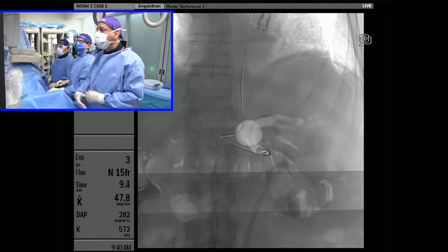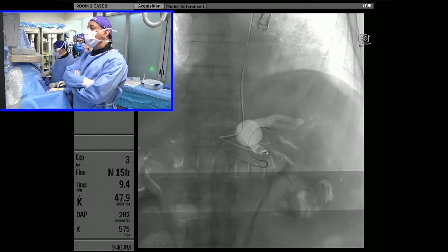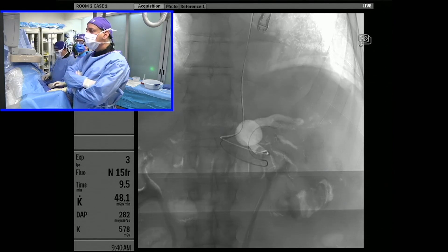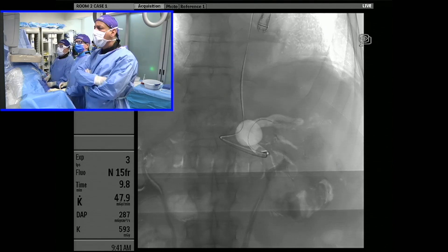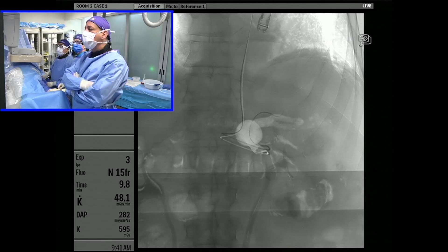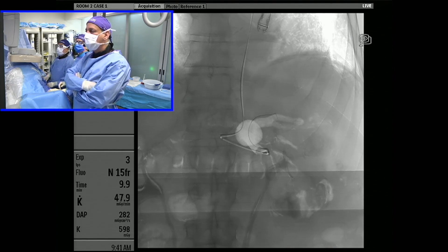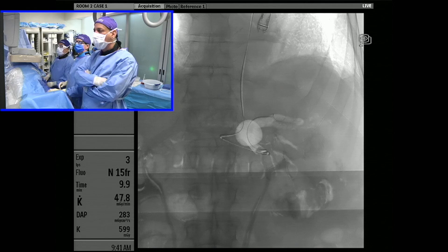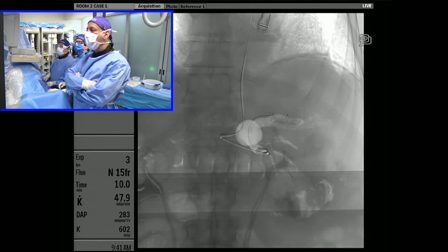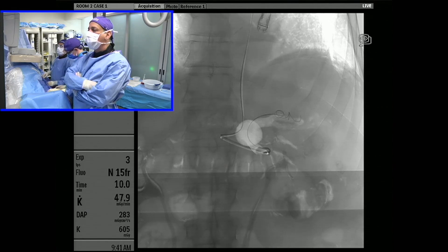The outflow vessel diameter is about 10 millimeters, and for this we're using a 14-millimeter diameter coil as our first coil. Obviously the first coil and the last coil are the most important from a technical standpoint. This may take a couple of minutes to seed the right way. That actually looks really nice — we're seated right on the bifurcation.